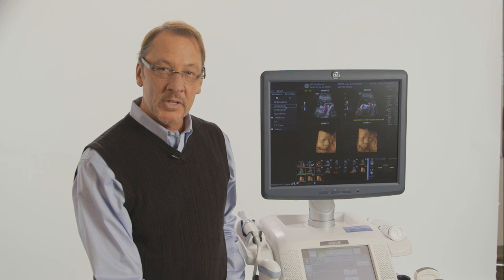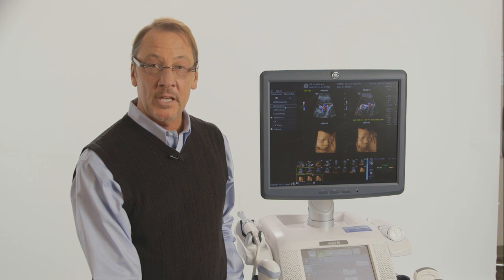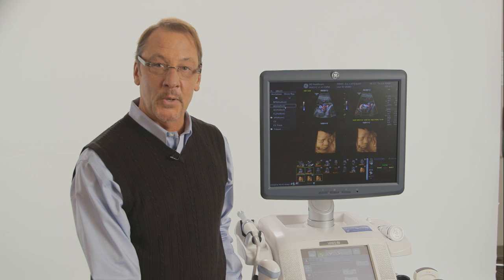Welcome to the Logiq Series video tutorial volume imaging guide. This video will help provide an introduction to volume imaging and manipulation using an automated or 4D probe.